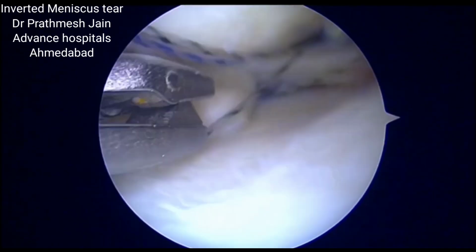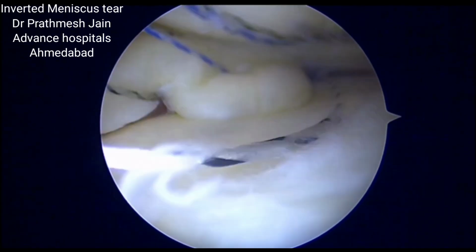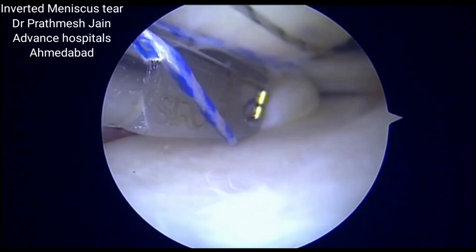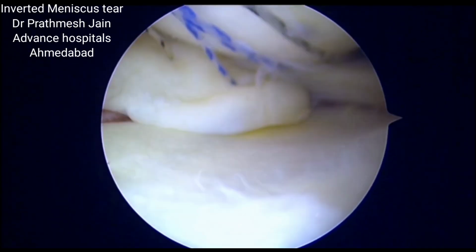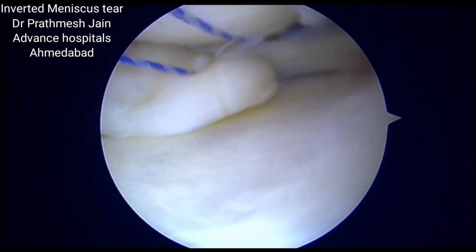So these techniques are particularly useful. You can do it in two techniques. You can do either a box stitch technique or use a rootfix anchor, and this would lead to a very nice position of even these sorts of bad root flap tears.